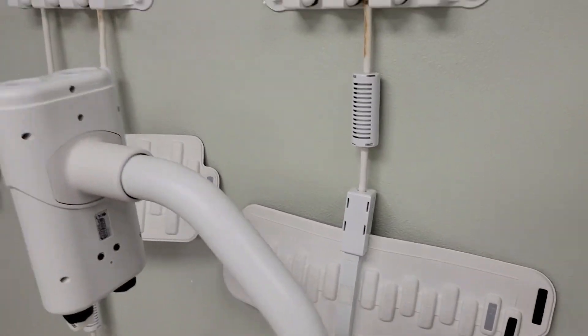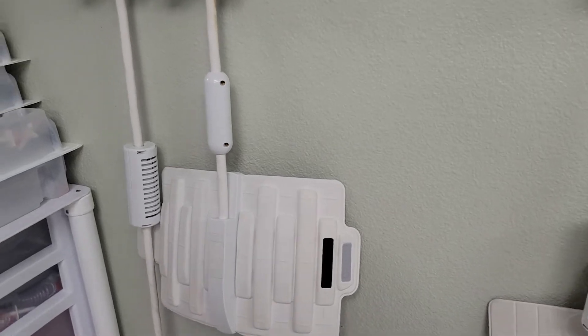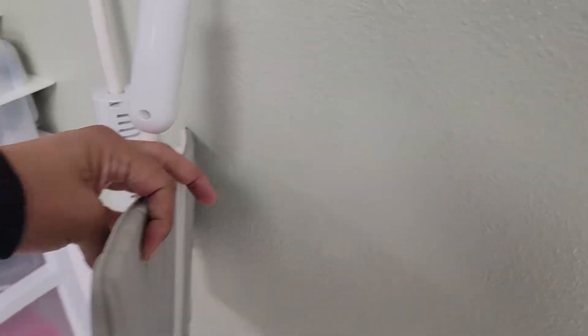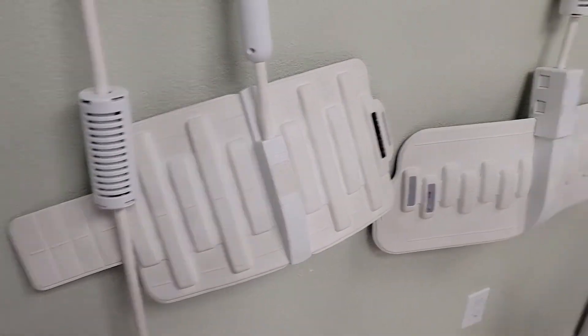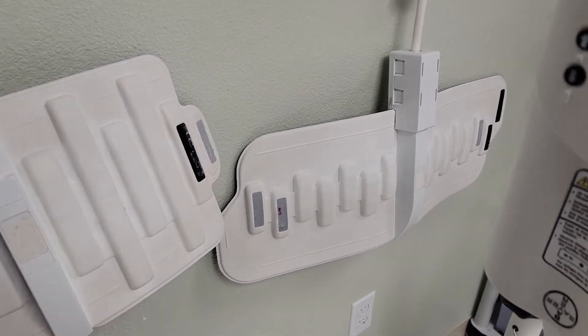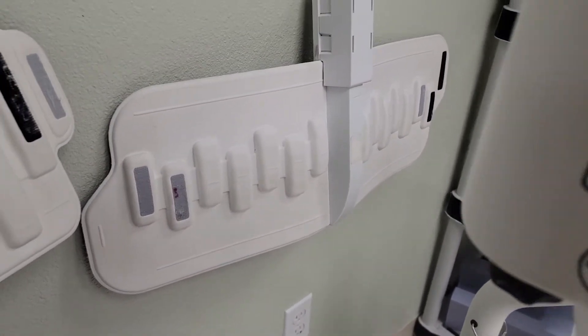All of these on the wall are called flex coils. They can give you some great images — you can either wrap a body part around with this or lay this on a body part and you're going to get some really good images. Three different sizes: small, medium, and large. You can do shoulders, hips, hands — you can even scan a brain with that large one.